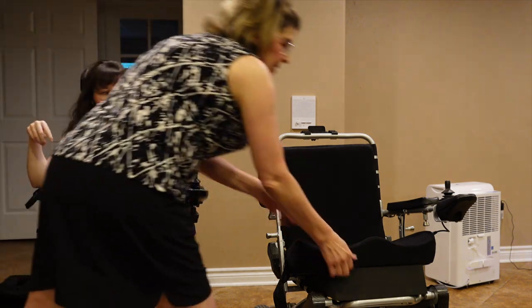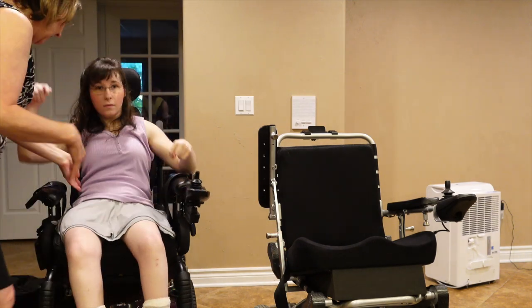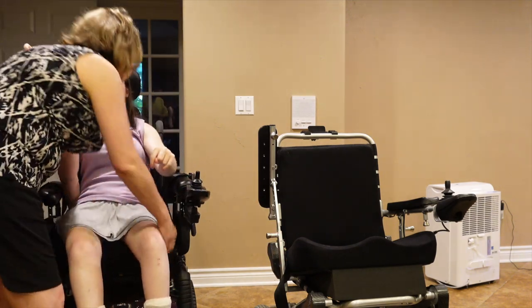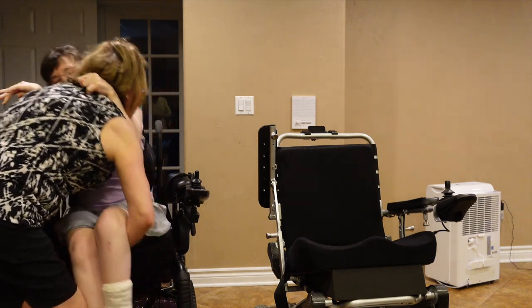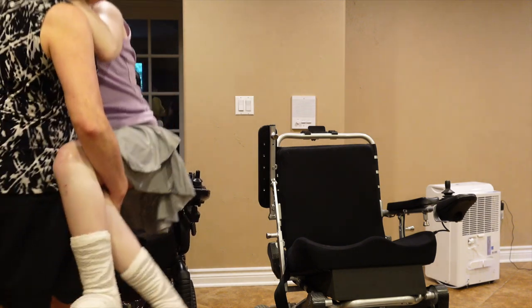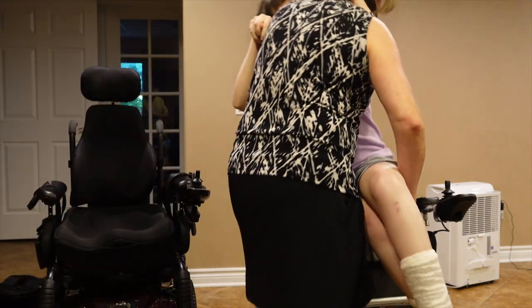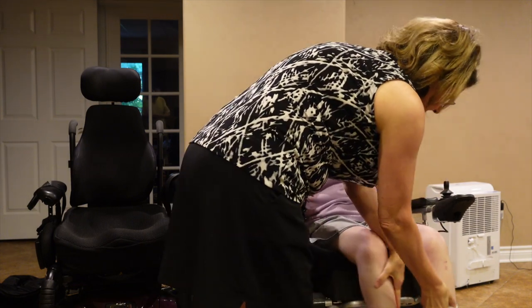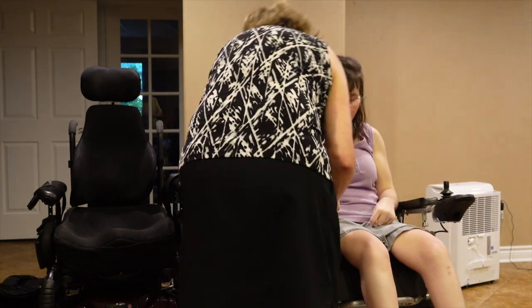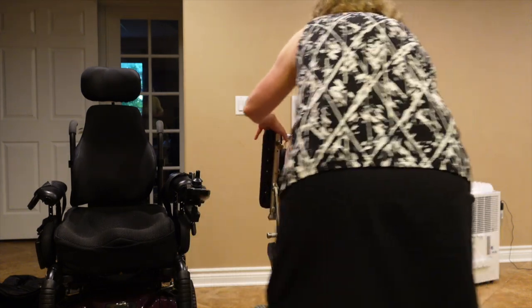So now we're trying — I put in this wedge that we got. We ordered that. One, two, three — up. That's really good. So that's the case then. We need to raise the foot rest.